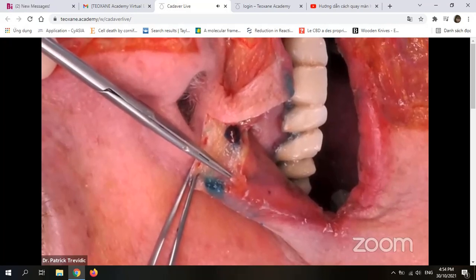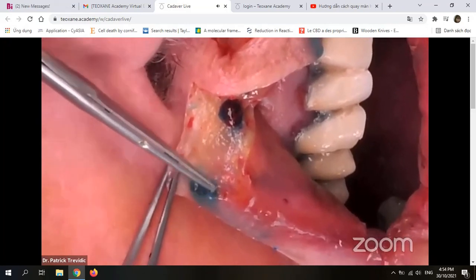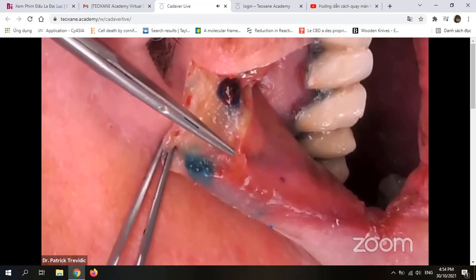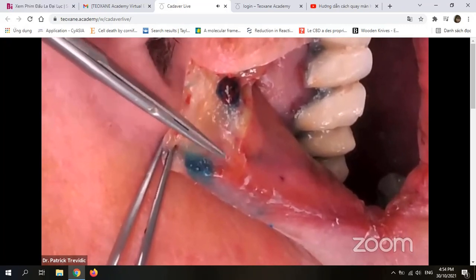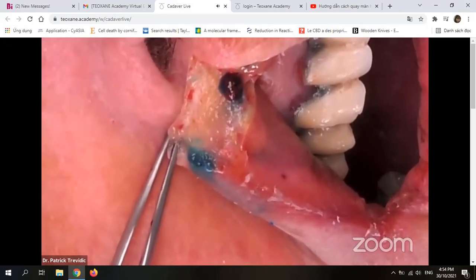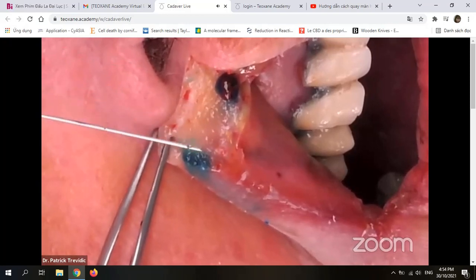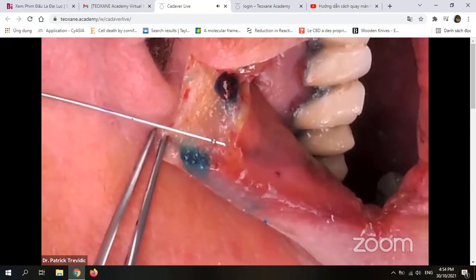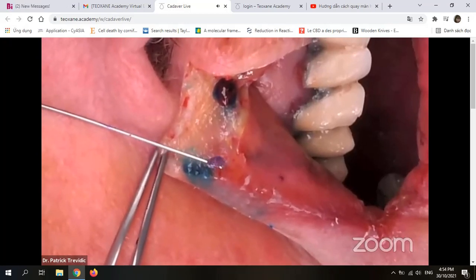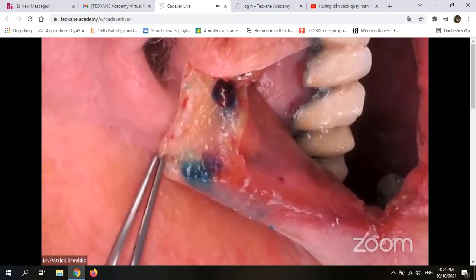If we focus on it, you see this artery here. This is my artery. And if we focus on this artery, she could be 2 millimeters up or 2 millimeters inside the muscle. So the area of this artery, if I put a bolus on this area to show you where could be this artery, could be just like this, like my deposit here.